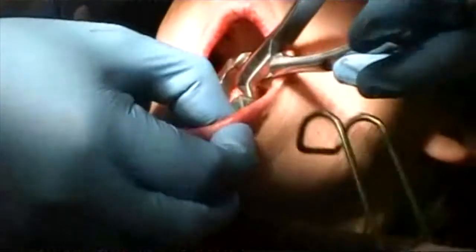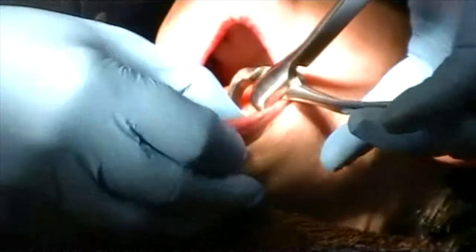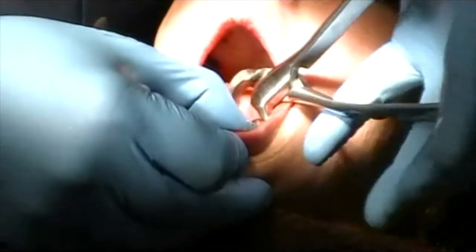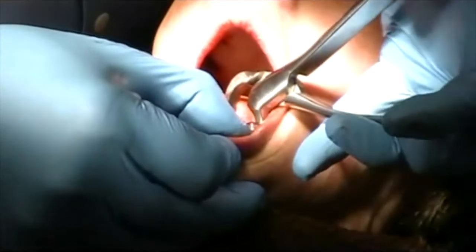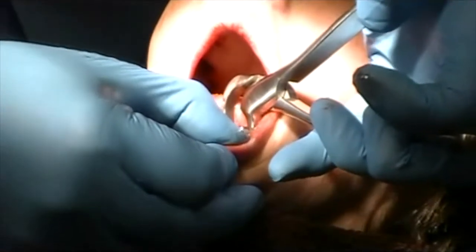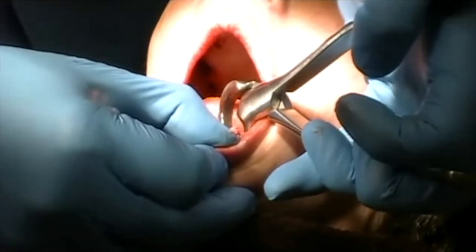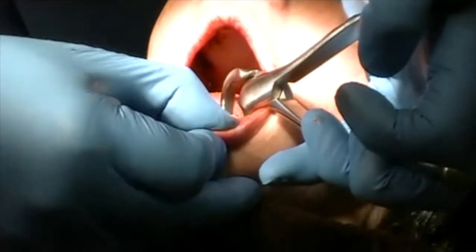Here I'm actually working left-handed. This tooth is really decayed on the facial. I'm using my left hand now — I'm a right-handed dentist — but using my left hand. Chin up for me, please.